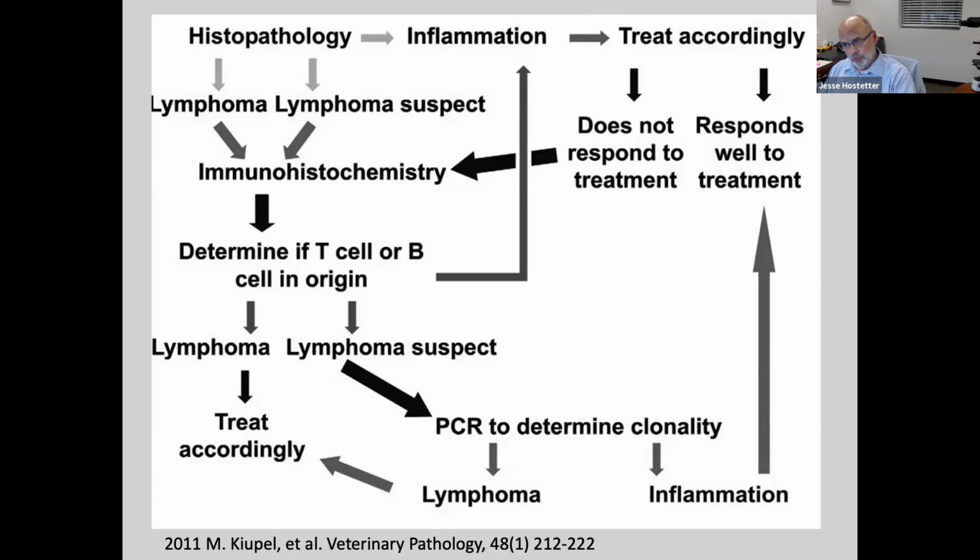Did it lose its brush border? Does it have vacuolation? That vacuolation of the cytoplasm can be a very acute change. Is it poorly differentiated? Does it have signs of injury? And if it does, and it's lifted off, then I would think those two are related. If it's really well differentiated and it's got a brush border and it's polarized and it looks like its neighbors that aren't lifted off, I guess I would need a little more evidence to make me think so.